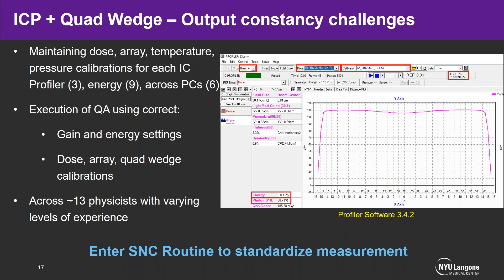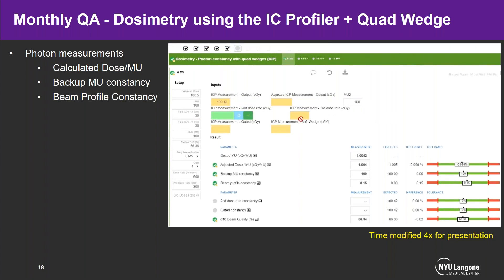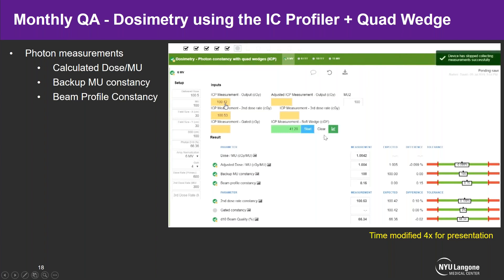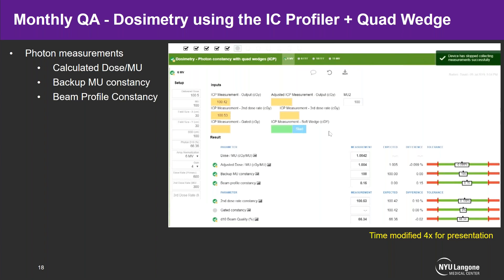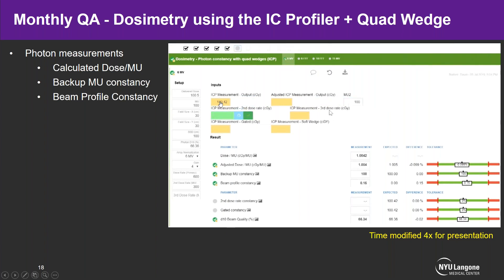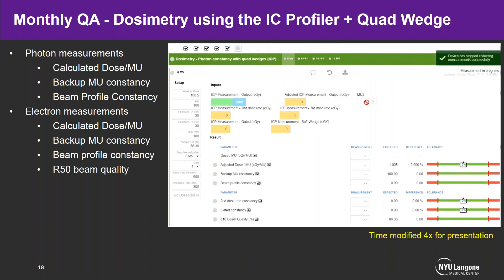Across 13 physicists with varying levels of experience with the software, implementing all the required parameters perfectly every time was going to be too challenging — but thankfully SNC Routine came out around this time to help standardize the measurement. This is an example of monthly QA using the IC Profiler and quad wedge, shown here as a video sped up about four times. For photons, the first row does the primary output, then a secondary dose, then an EDW, and also gating. In these four measurements, everything is done with really just one setup, and simultaneously the D10 energy check and beam profile constancy are being performed.